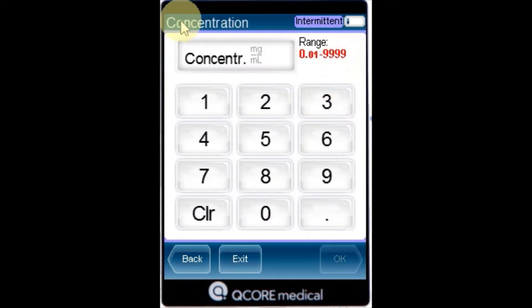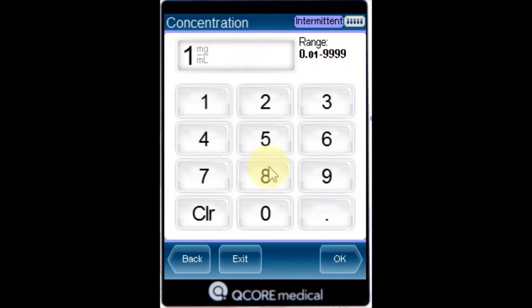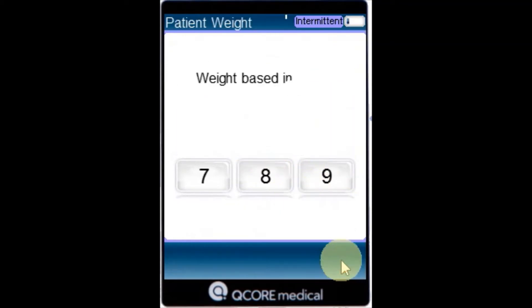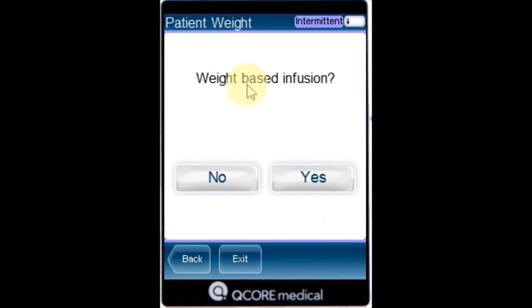From the concentration screen, using the keypad, enter the concentration, then press OK. If the patient weight screen appears, specify whether the infusion is weight based.